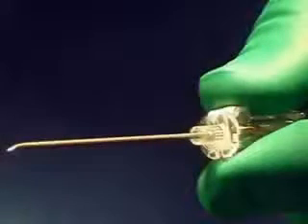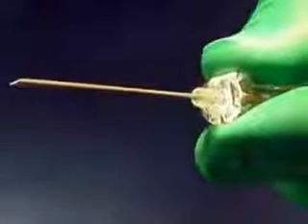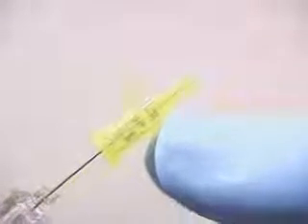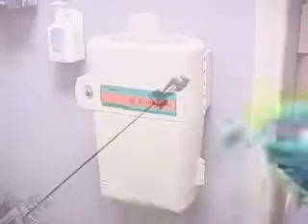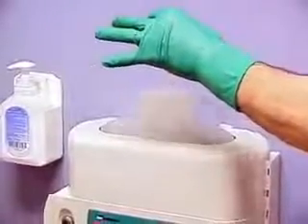Different safety mechanisms have been developed to minimize the possibility of inadvertent needle sticks. Some catheters are equipped with a spring-activated retractable needle. Others have a protective clip that covers the needle as it is withdrawn from the plastic cannula. Needles should always be discarded appropriately in a sharps container.